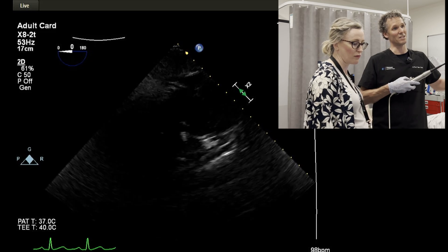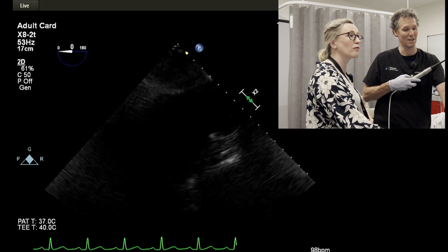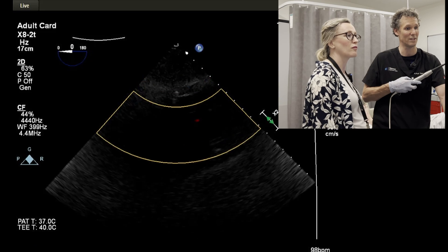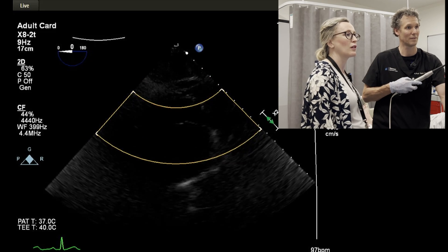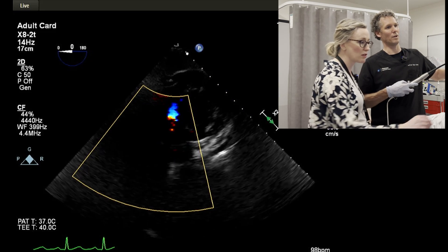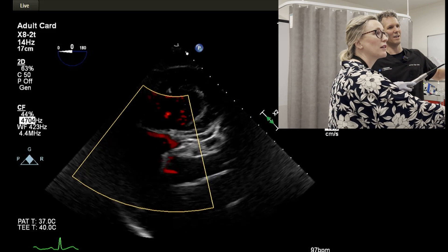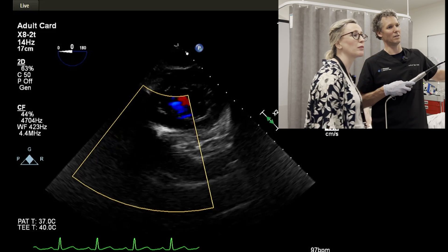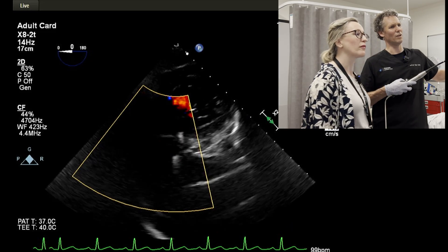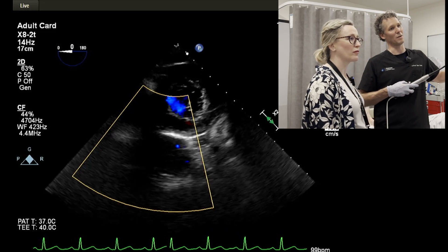Here you can just see the aortic valve starting to come in. I use colour in this to try and find it. Just gently pulling back, and I think I'm starting to see the aortic valve coming in there.